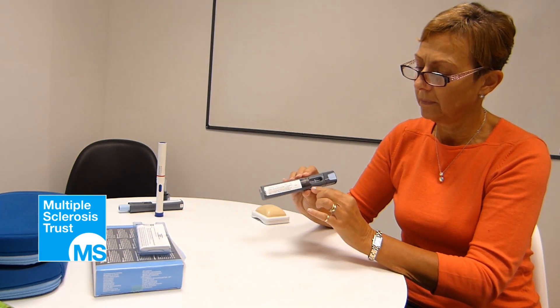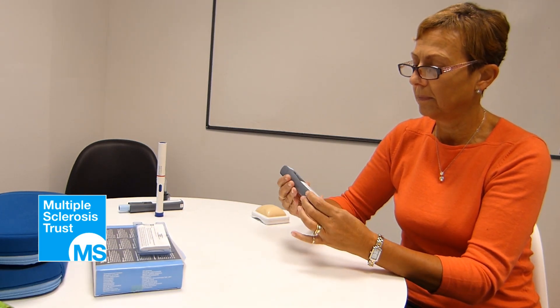Always check the pen before an injection. Check the expiry date printed on the pen and box. Don't use a pen that's passed its expiry date.